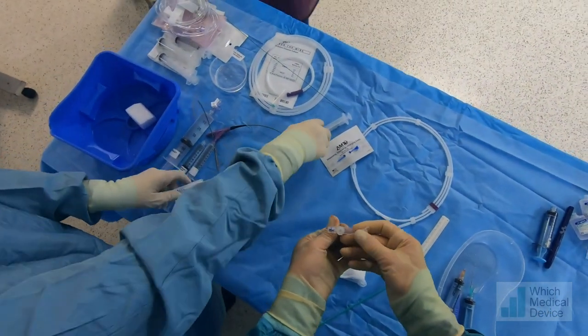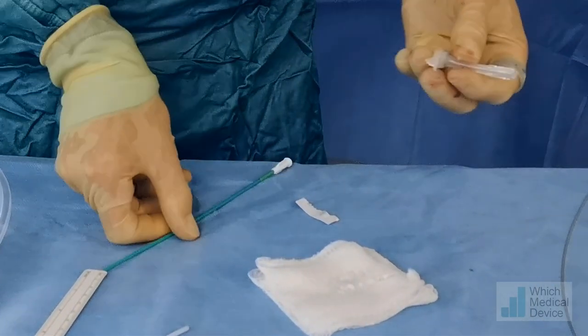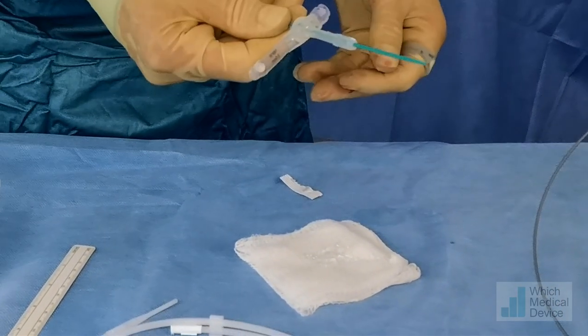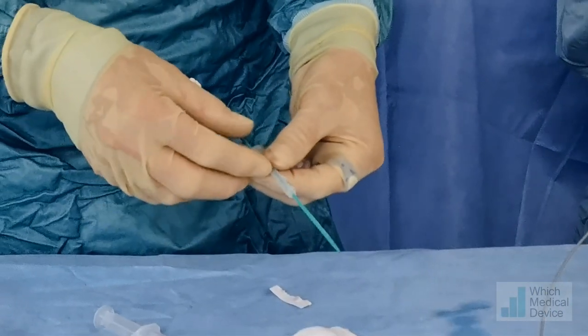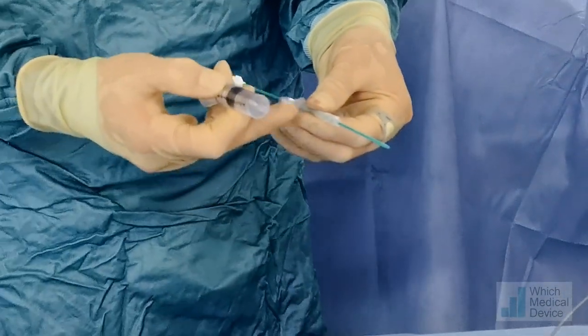This is the little gastrostomy tube we're going to use: 16 French, 3cm long. We'll put a little bit of gel on it and pass a dilator through the middle just to stiffen it up and give it more rigidity when inserting it over the guide wire. There's a balloon on the end — once in position we're going to inflate it with 1ml of contrast and 5ml of water, so a total volume of 6ml.